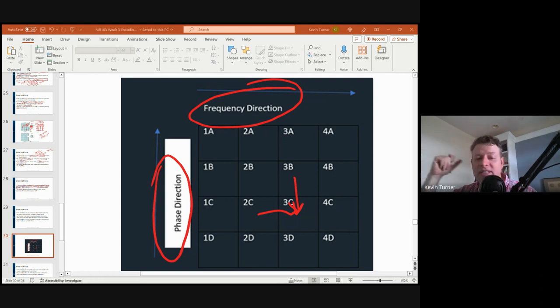So yes, a lot of times they're set. But guess what a lot of techs do? They open it up and they say, it's not how I scan. Do this, this, this, this. You're like, can I just run it the way it came? It's because every tech thinks their kung fu is better than everybody else's, right? Including me.